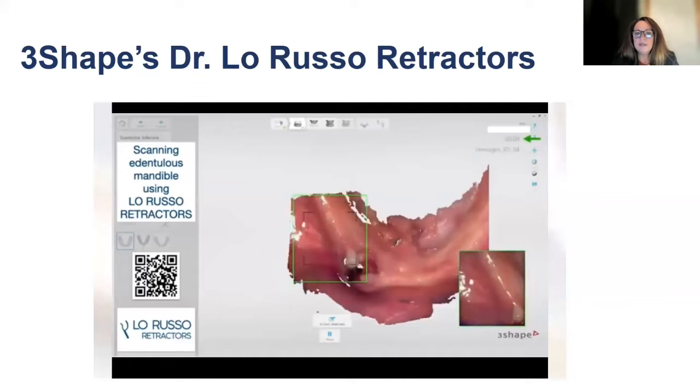Kelly, we have a couple questions. Is it easier to manipulate the scanner or to move the denture base? Probably when scanning in the hand, you really want to keep that denture stable. Still, because if you have two moving objects, it's going to keep falling off. It gets hairy real quick, right?